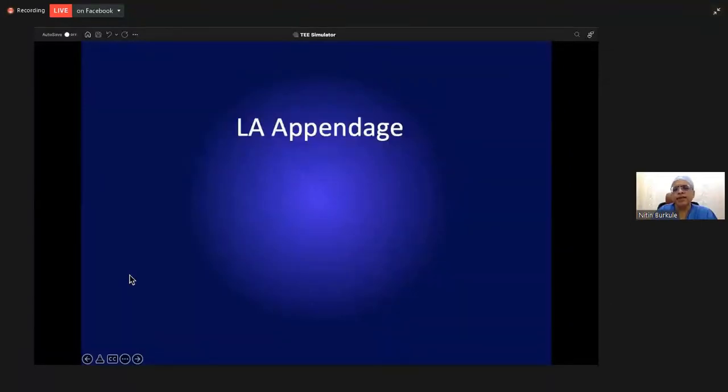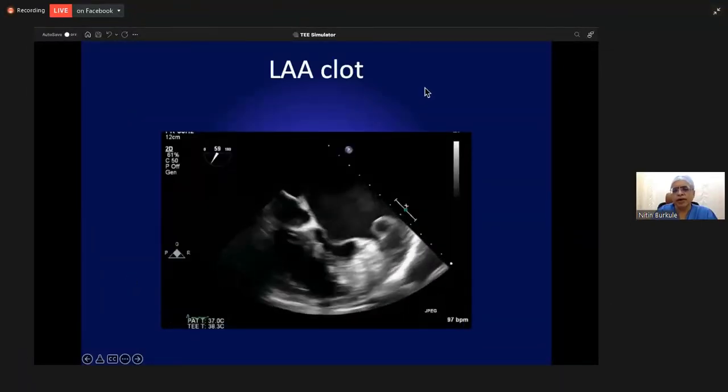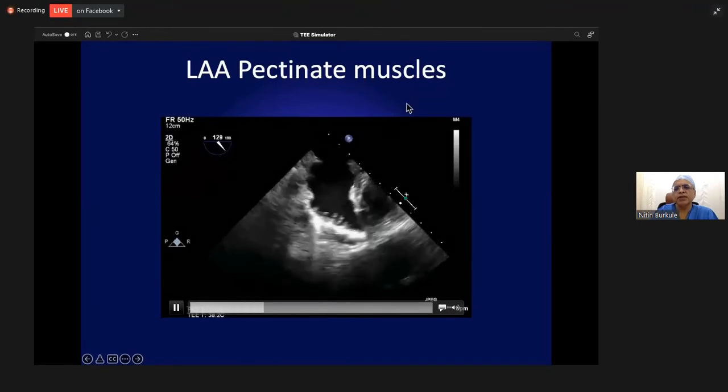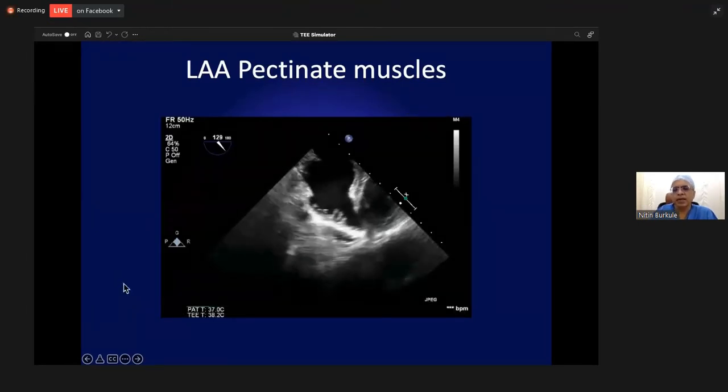LA appendage, looking for the clot, like this one before the mitral interventions or before the cardioversion. And these are the pectinate muscles which may sometimes get misdiagnosed as an LA appendage clot.